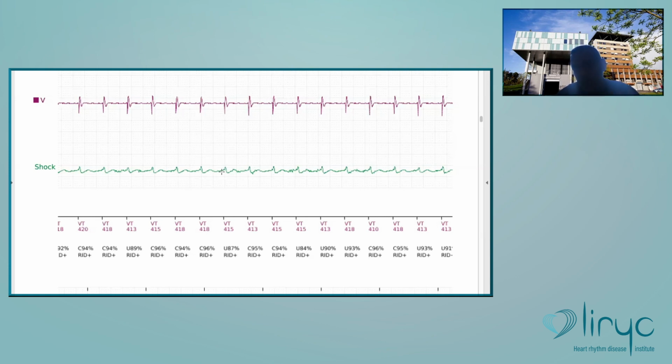Therefore, at the same level of percentage, the specificity is way lower for Boston compared to Abbott. So in Abbott, I will not modify too much the nominal value, but in Boston, I will do it. And I will decrease this value to increase the specificity in discrimination. Is this clear? Good.